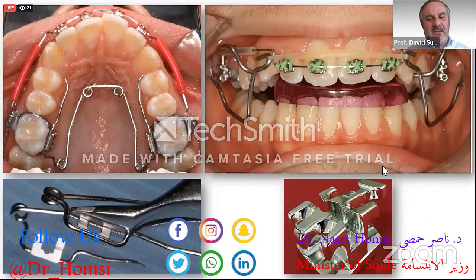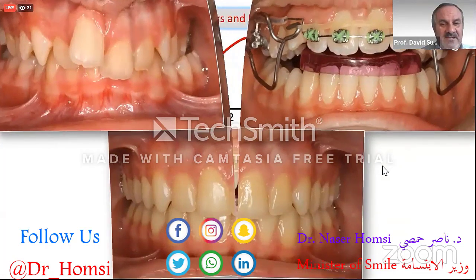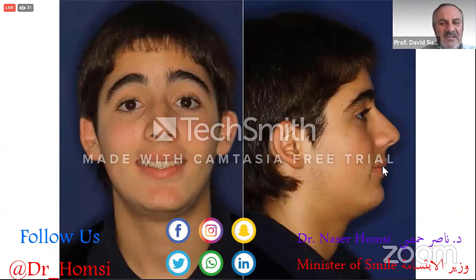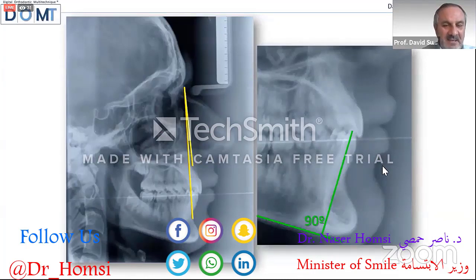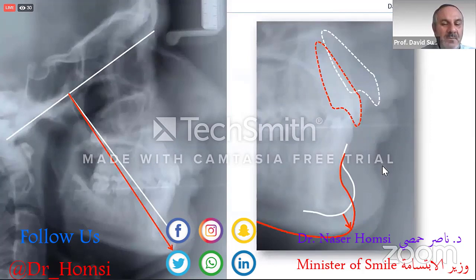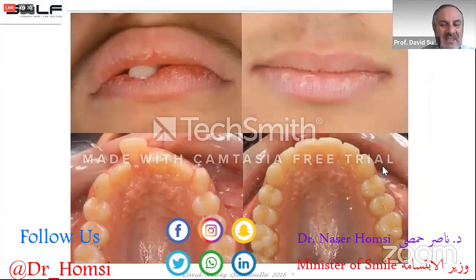We use the combination of the twin block, the Bionator with first the Quad Helix, and second the Bionator with brackets and wires. And you can see here, finishing the treatment very fast. You can see the face of the patient, it's completely different in this type of patient. The first step was the protrusion of the upper incisors. The second point was the use of functional appliance to stimulate the dentoalveolar growth of the mandibular bone apical to the teeth.